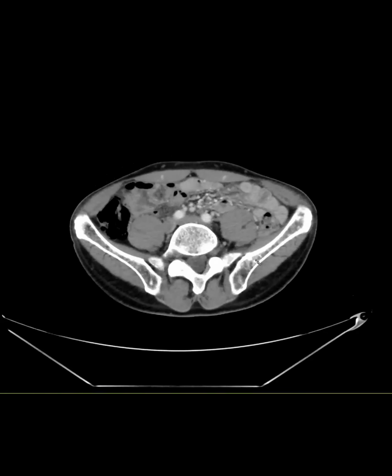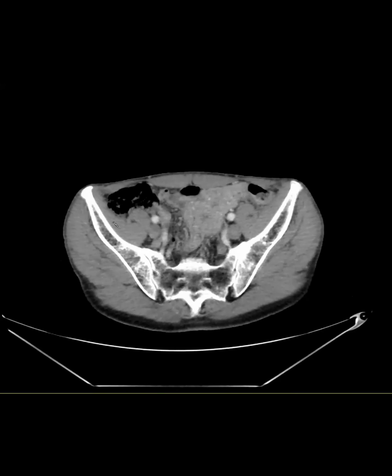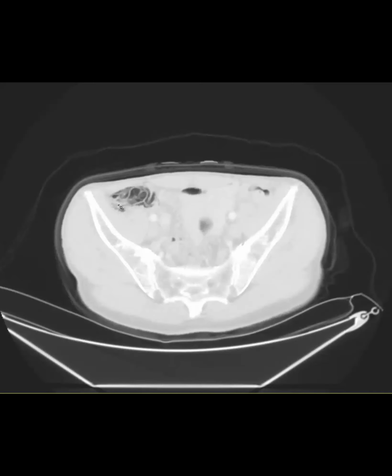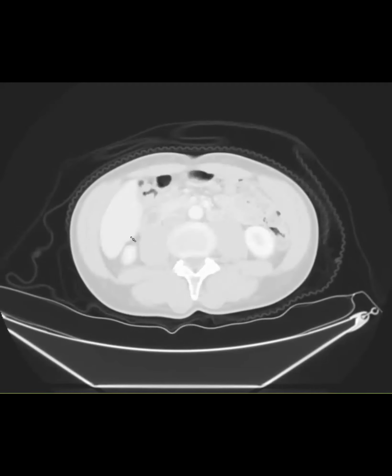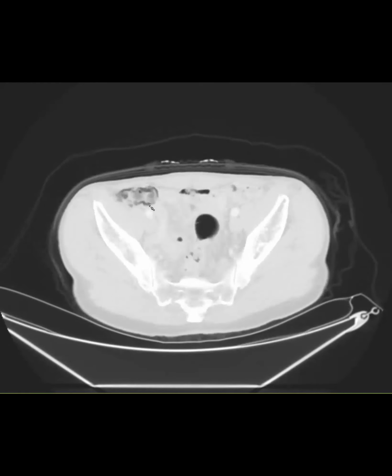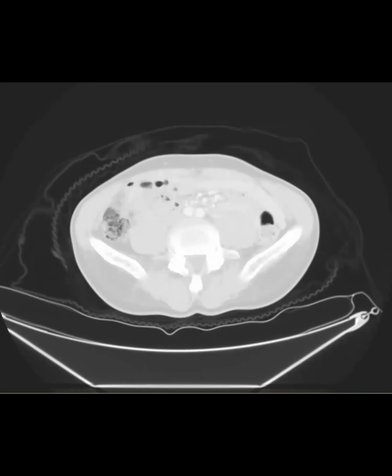And then this patient had abdominal pain. They were an outpatient and everything was looking okay, but we can see this subtle finding here, more easily seen on the lung windows, where we have pneumatosis of the cecum. And the patient wasn't very sick. So this is another kind of benign pneumatosis, but we think this was also related to COVID.